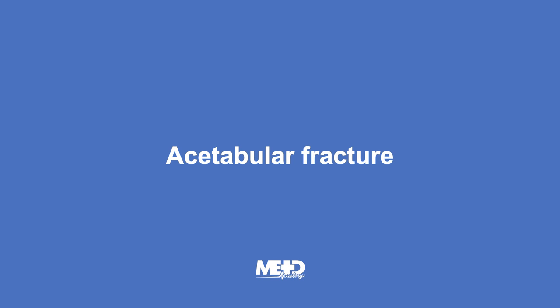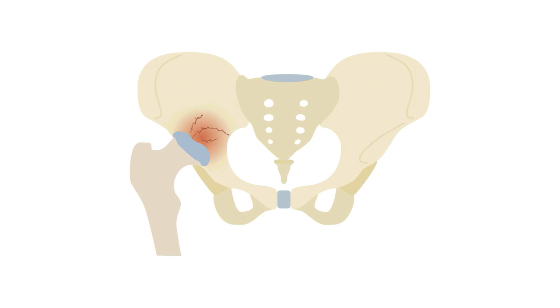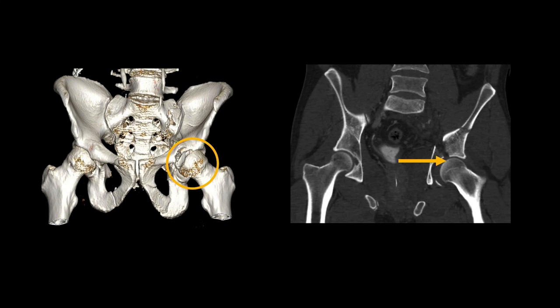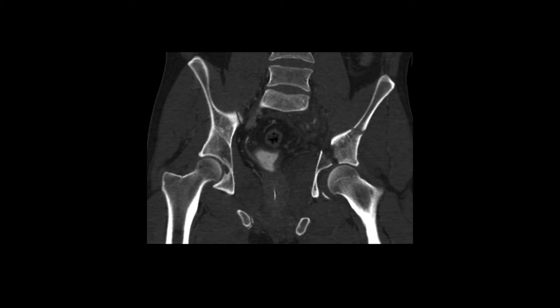Acetabular fractures may accompany other pelvic injuries. Fractures of the acetabulum occur when the femoral head is driven into the pelvis. Acetabular fractures are best seen on the coronal images, where we can see the familiar appearance of the hip joint. In this example, there is a large displaced cortical defect in the left acetabulum, as well as fracture of the iliac bone.